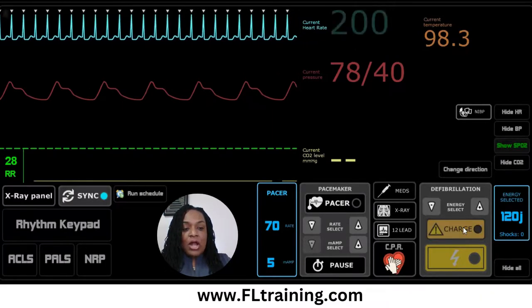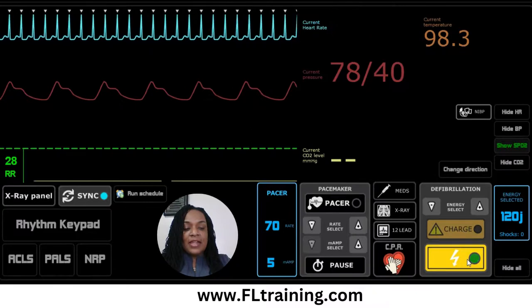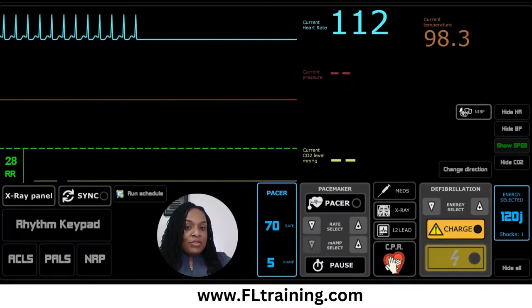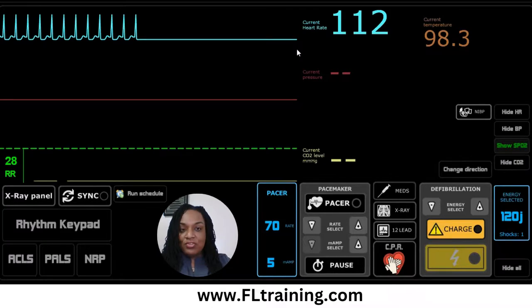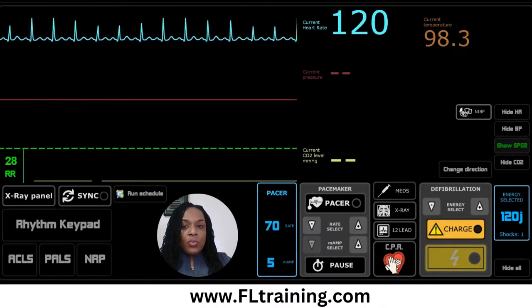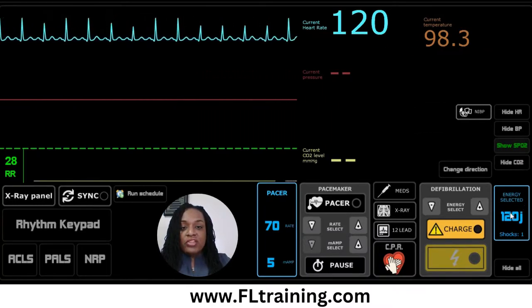Remember this patient is awake. We have fluids infusing for the blood pressure, but it will continue to decrease as long as cardiac output is low due to the high heart rate. Everybody's at the bedside. We're charging. We're going to clear — everybody clear. One, two, three — shock. We delivered one synchronized cardioversion attempt at 120 joules. Now it looks like our heart rate has normalized — I can see PQRS, I can see all my complexes. However, we don't treat monitors — we treat patients.